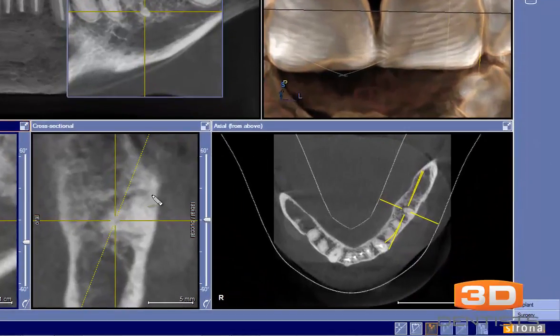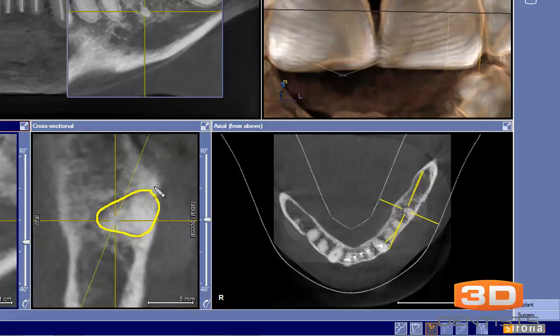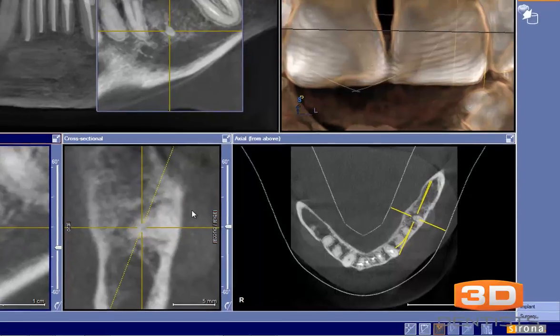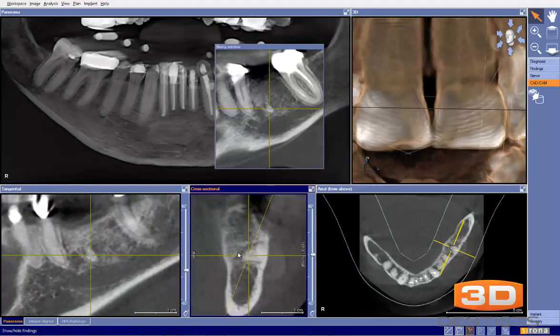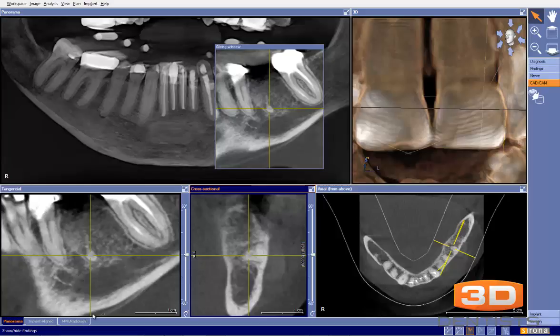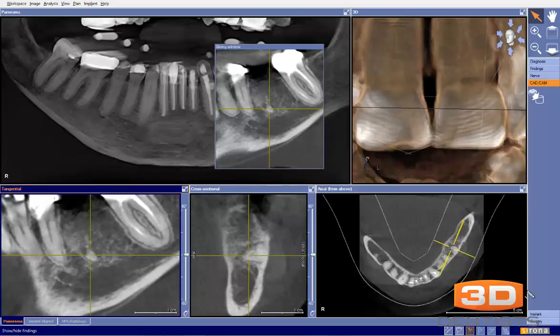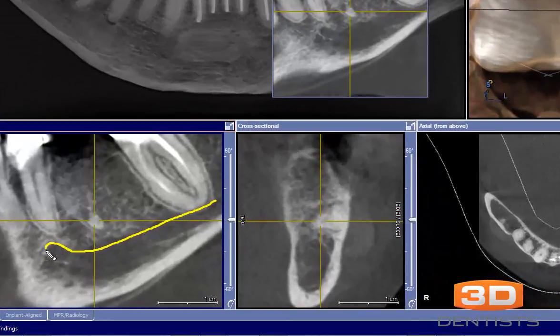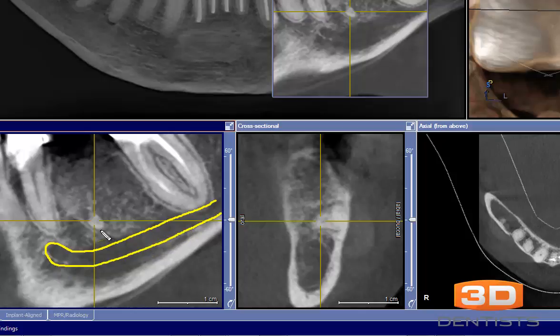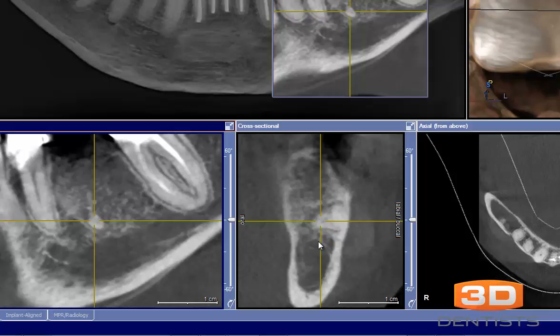The good news is that there is access to the root from the side. We could come down to the buccal plate of the mandible and get access to that root versus having to drill straight down. In some situations, depending on where the implants can be placed, you could do the osteotomy and try to tease it out. But given the buccal displacement of that root, side entry would likely be best. One thing we do have to keep in mind is the proximity of the nerve. We can see the nerve canal right there, so we have some room to gain access — our nerve canal looks to be down below.